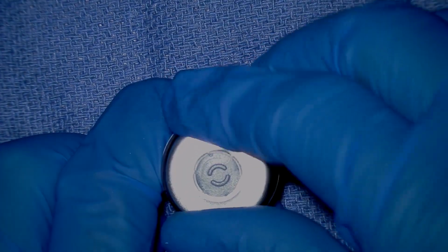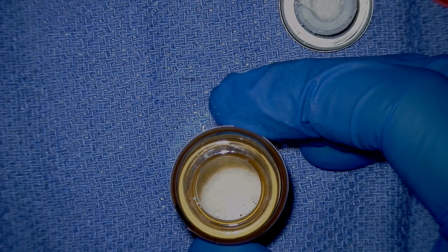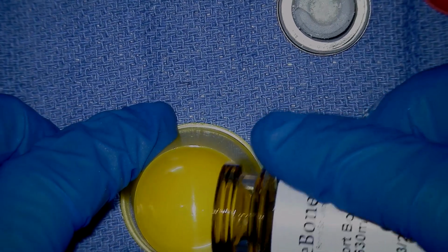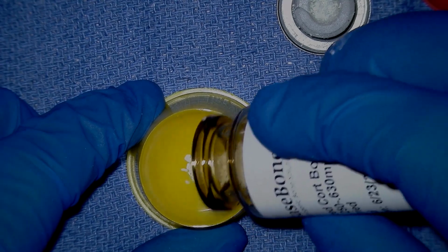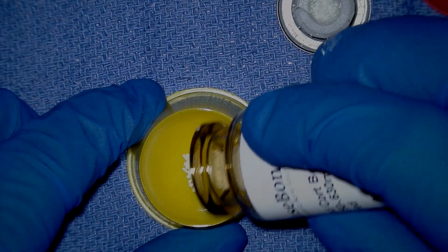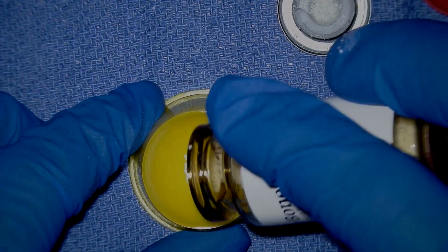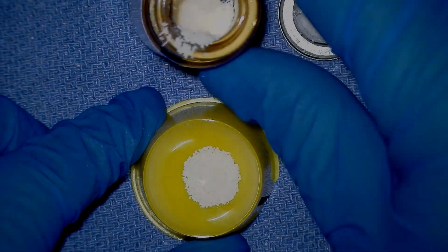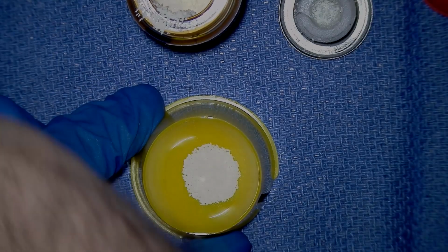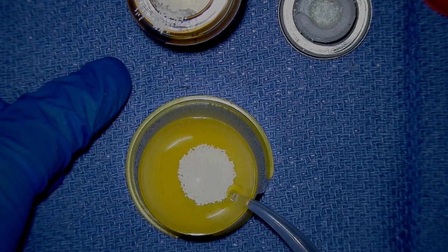And pop the lid off. There we go. I'm going to grab a dampened dish and just place the appropriate amount inside the dish. It just kind of comes out here. There you go. A little bit more. Perfect. All right. Now I have some sterile saline that I'm going to drip in there.